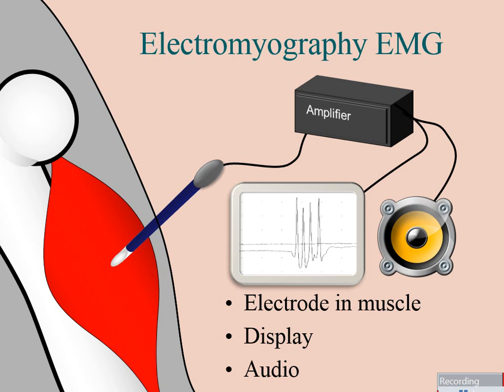The reason we listen to the audio is that these are transient waveforms flashing by, and we're trying to analyze these waves as they're flashing by. Our eye is not designed to do that, but sound is a transient waveform flashing by. And so our ear is programmed to detect and deal with that sort of thing.